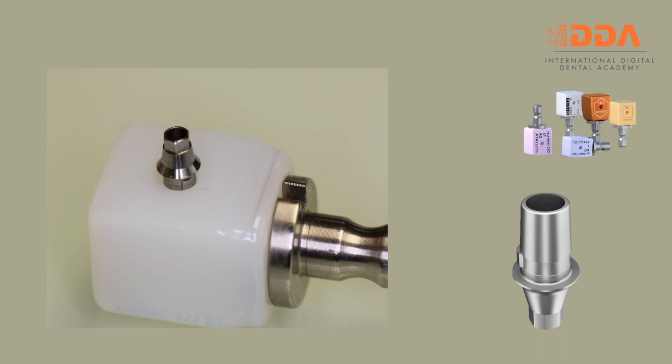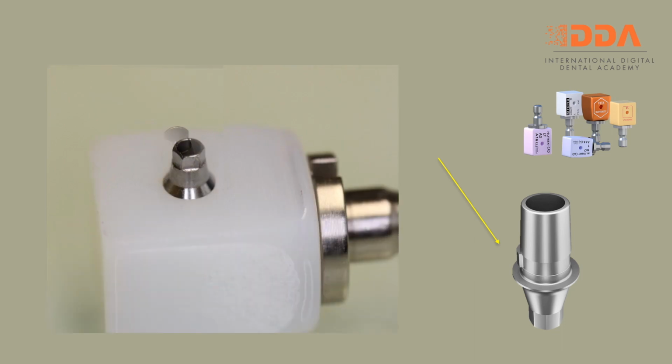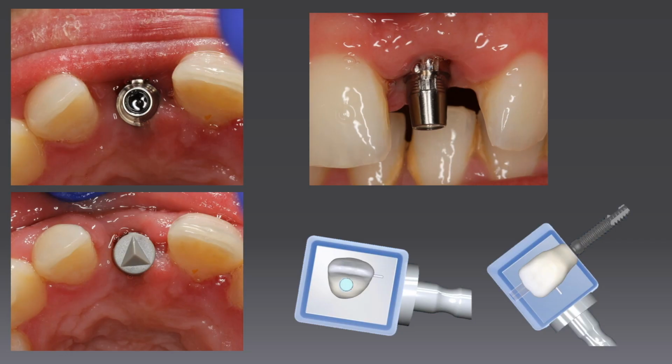Regardless of which block or material we use for milling, we need to realize that the Ti-Base is pre-manufactured with a specific notch, and this notch will allow the Ti-Base to fit in only one position within the block. Hence, that will prevent the rotation of the block on the Ti-Base and lock the milled restoration onto the Ti-Base.